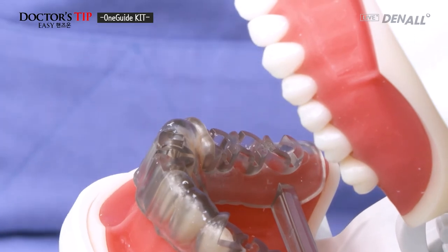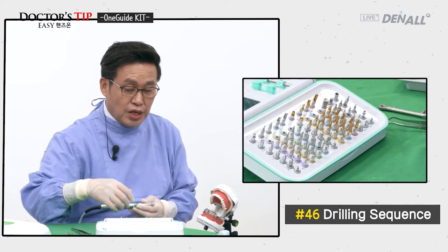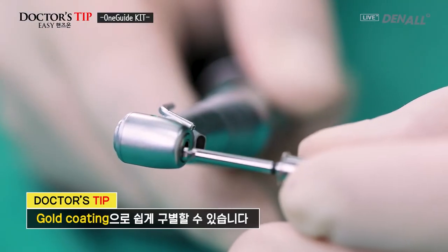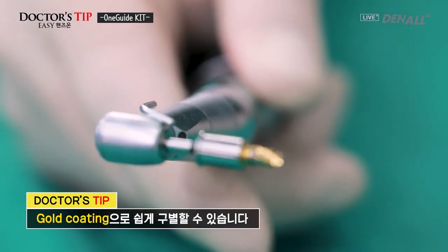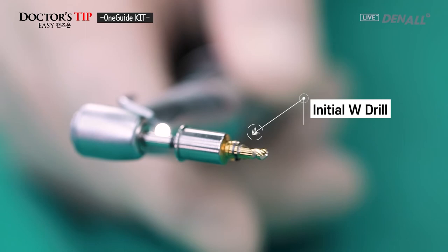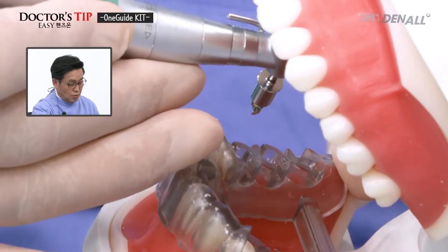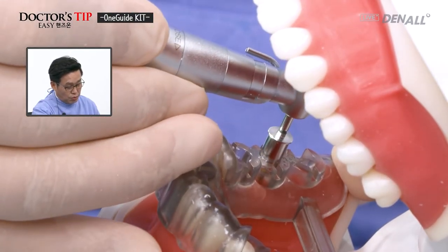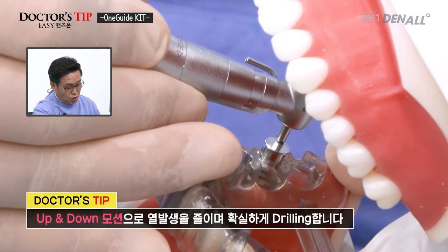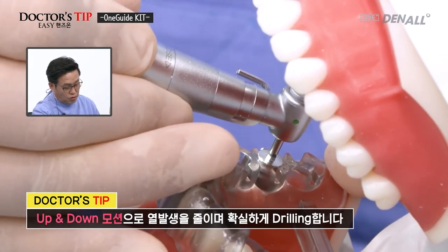Now I'm going to move on to 46. We did the tissue puncture earlier, and the same with 46, we use the initial drill. The 3.5 by 6 millimeter initial drill is going to be used. The barrel is going to be the 5.7 barrel. I'm going to use the OneGuide drill and change to drilling mode. After I do that, you can see that this is in full contact and initial drilling is going to be done. Because there's heat generation, I'm going to do an up and down motion and drill in full length.